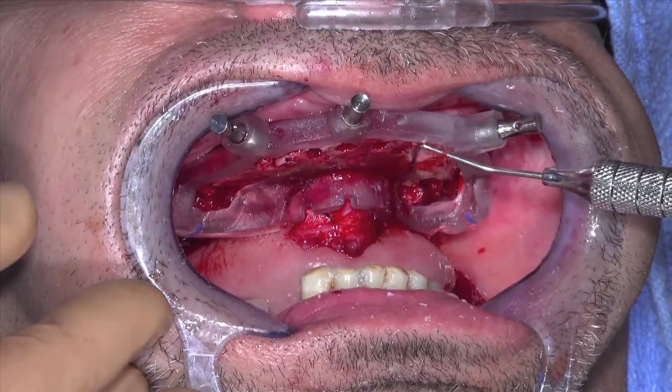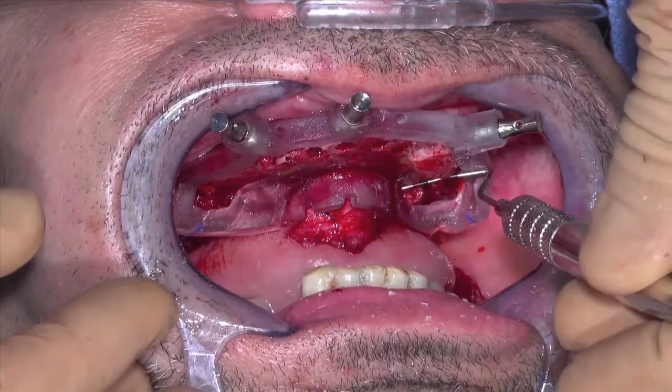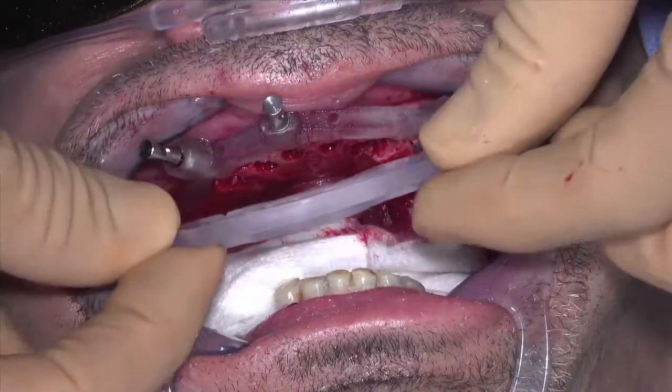While holding the probe so it is contacting both the palatal and buccal flats of the bone foundation guide, slide the probe across the alveolar ridge to identify any high spots.